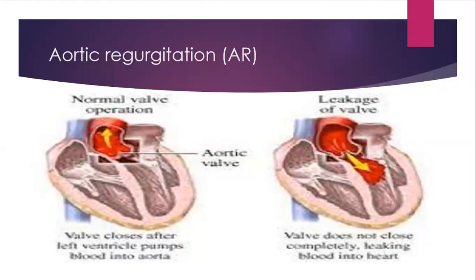Ideally, there are also other areas like endocarditis and pericarditis, and how they appear in echo. We'll look at them later on because they are a product of rheumatic heart disease.